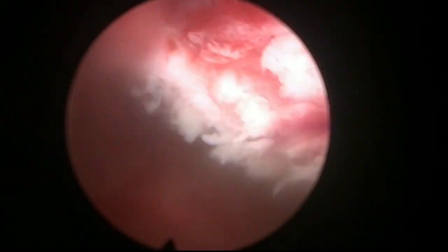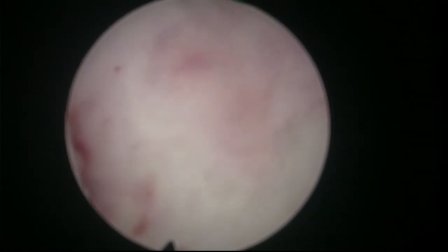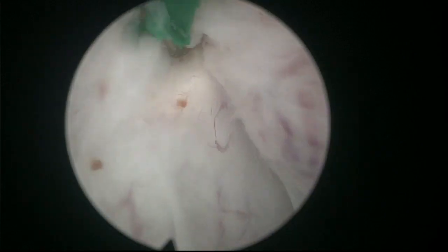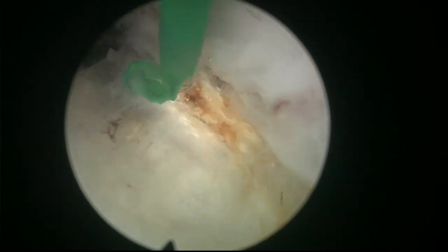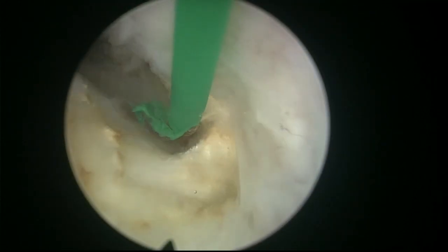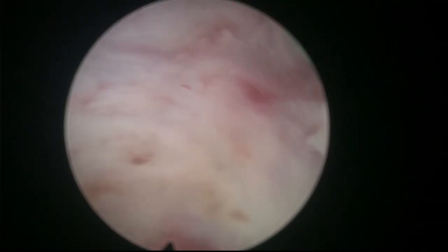Then to lift the other side, I think we are now in a position to try to tilt the adenoma into the bladder, just by pushing it carefully. That's the prostatic urethra. You see, this lobe was almost wanting to go in, but many times this possibility is limited by the remaining attachments at 6 o'clock. If the pedicle is very wide, sometimes it's difficult to push the adenoma into the bladder. So it's nice, let's say, to make it less wide, to catch the attachment at 6 o'clock towards the midline, so the hinge that the prostate will use to rotate is much smaller.